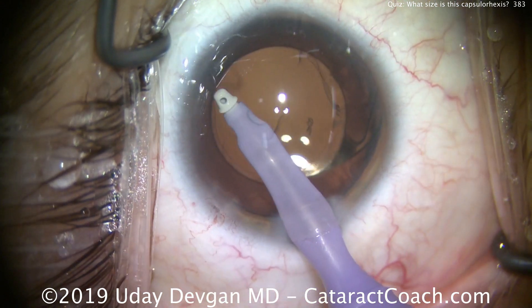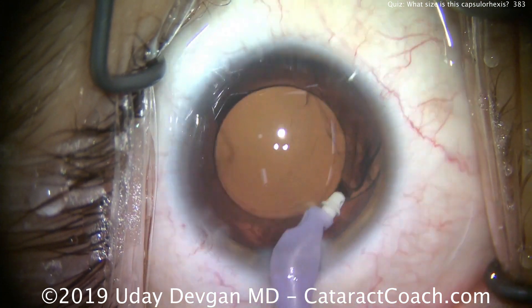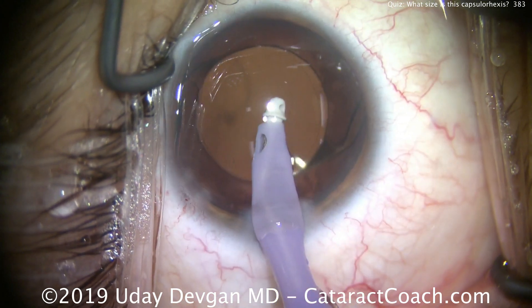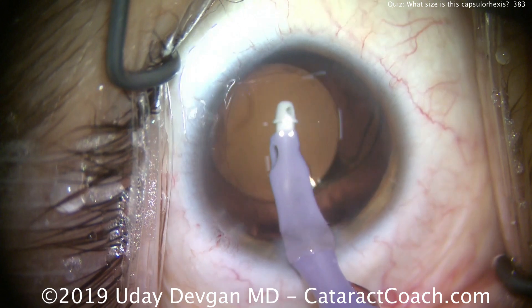The patient also dilates very well, so what seemed like a relatively small capsulorhexis at the beginning of the case turns out to be just about perfect. If you look carefully, the overlap on top of the optic is great for 360 degrees.